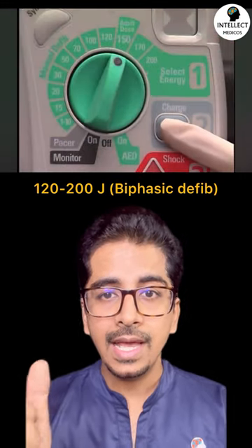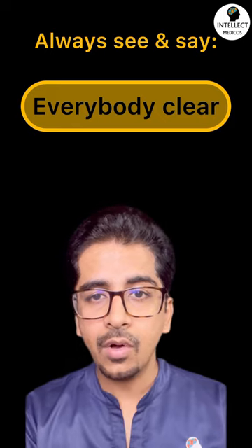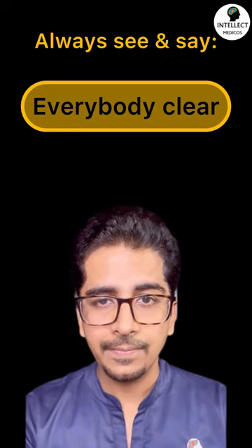Select the energy, then charge the defibrillator. Before delivering the shock, always say 'everybody clear' — nobody should be touching the bed or the patient, and there should be no free oxygen in the surrounding area. Then press the button to deliver the defibrillatory shock.